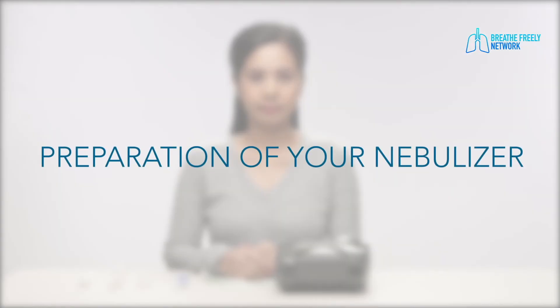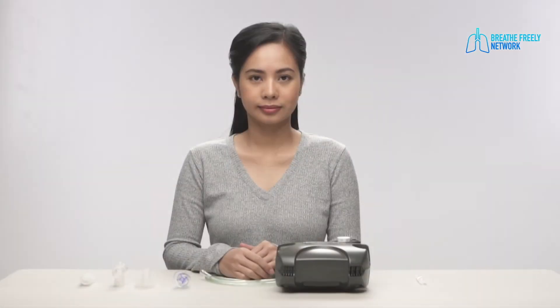Preparation of the nebulizer. Proper hand washing should always be practiced. Be sure your equipment is clean before using it.